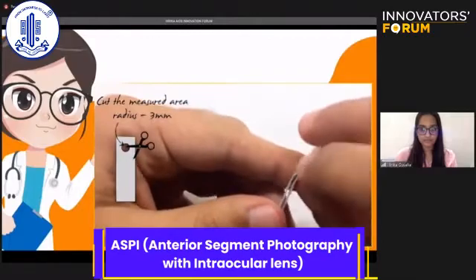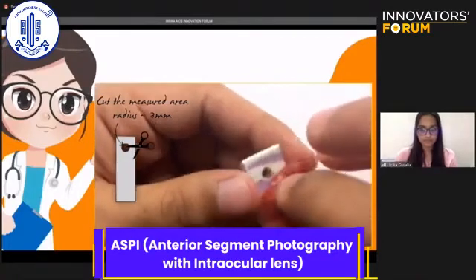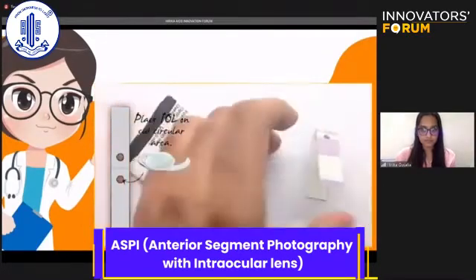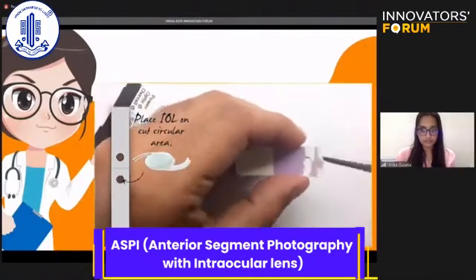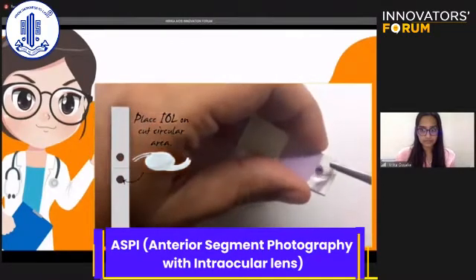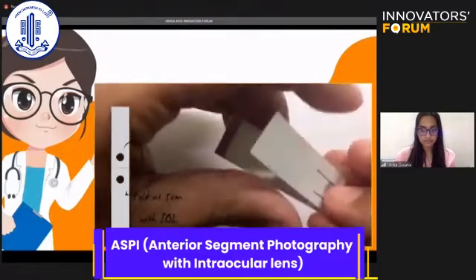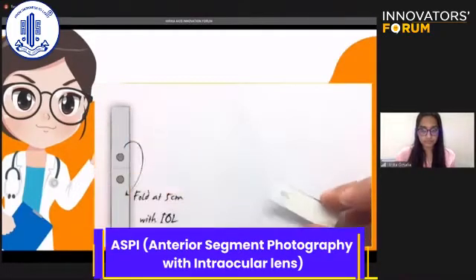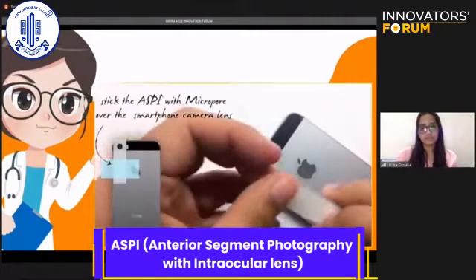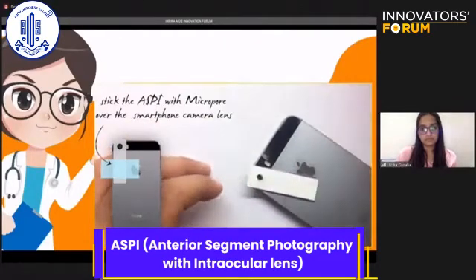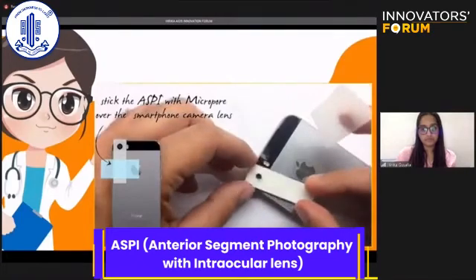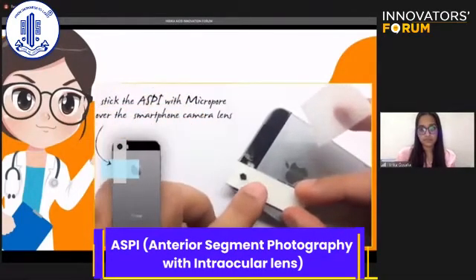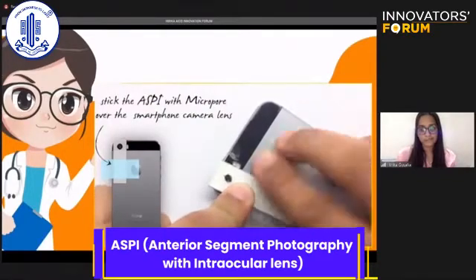Remove the other side of the double-sided tape, take the 15-diopter intraocular lens, and attach it onto the circular opening. Then stick the other side of the chart paper to sandwich the intraocular lens on both sides. Finally, attach the ASPI onto the smartphone camera with a rubber band or a Micropore — and it's ready.